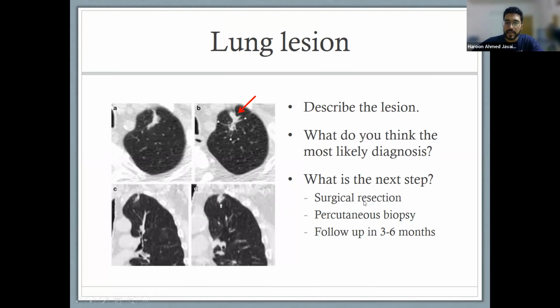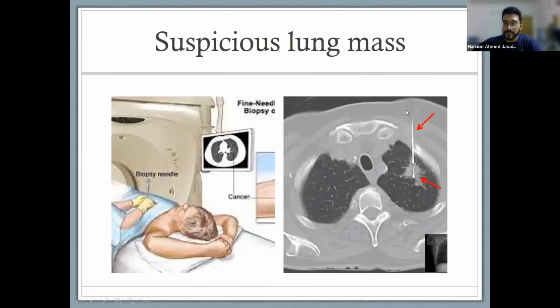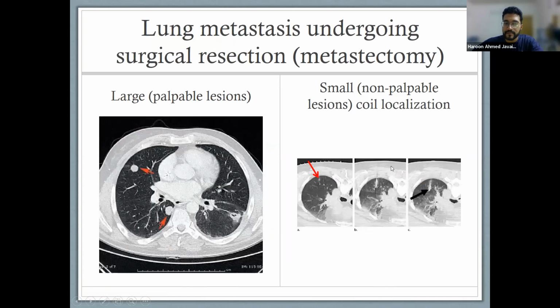So what they do is percutaneous biopsy. So once they're doing percutaneous biopsy, they take a needle, and so this is still a CT scan. They'll take a needle and they'll go for a biopsy. So metal is very bright on a CT scan. They know exactly where they're going, and then they'll take a sample of this thing over here. Okay, that's where the intervention part comes in.